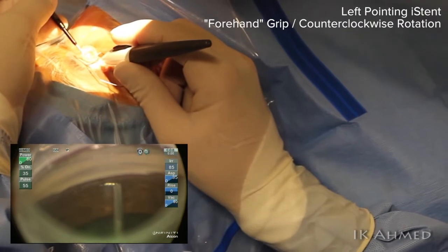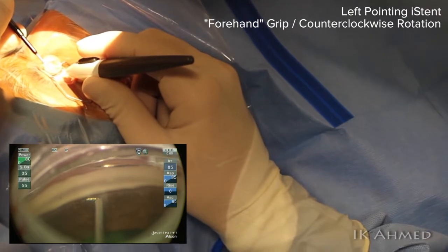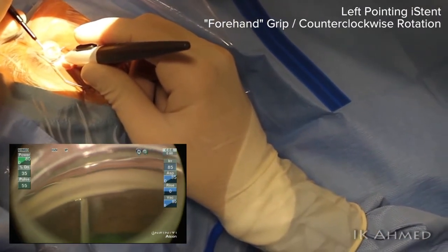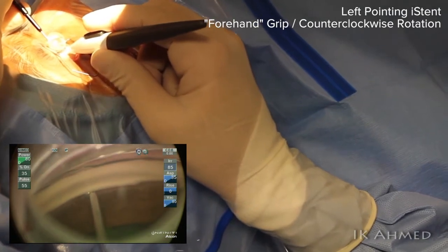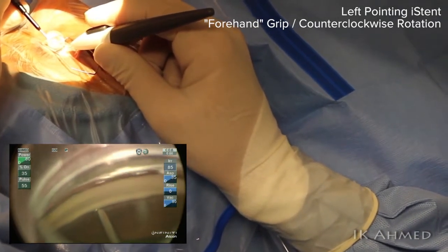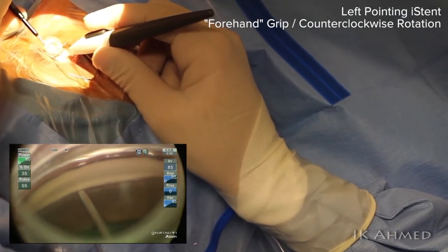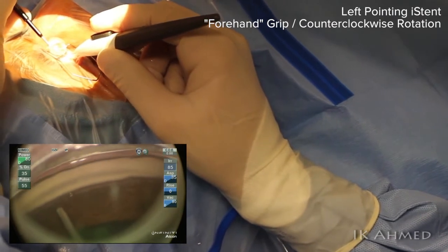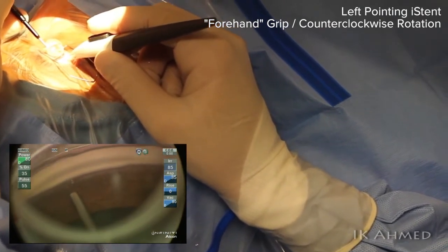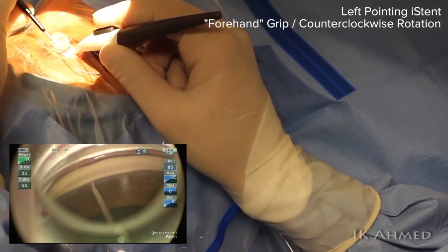A 30-degree approach is used to approach the angle as seen here. Notice our finger is ready to release the button once implantation has occurred, and once we have the device in the canal, the device is pulled toward us to ensure we have adequate purchase within the canal. Notice the degree of rotation of our hand — about 30 to 40 degrees — which allows the device to follow the contour of the angle as it curves around from the horizontal position.